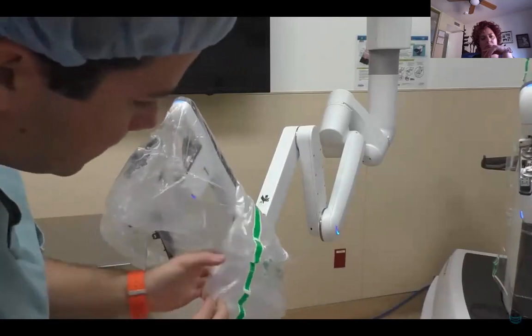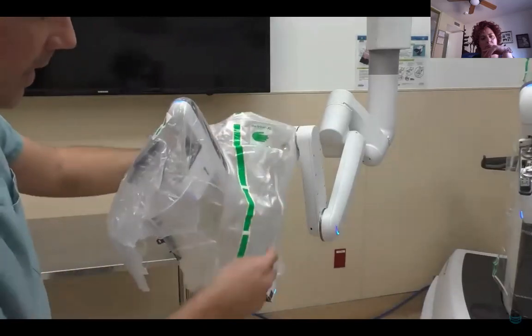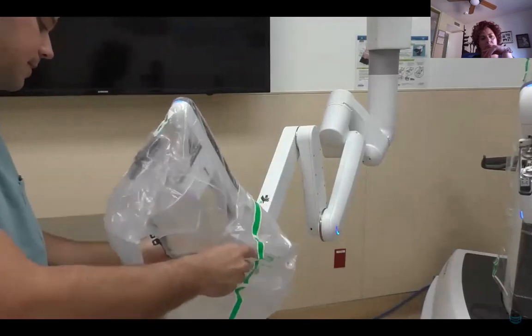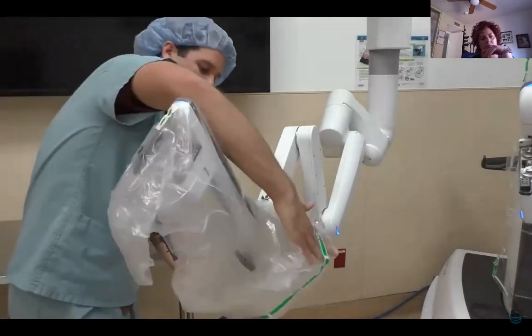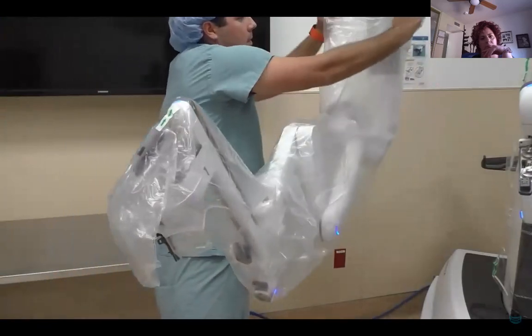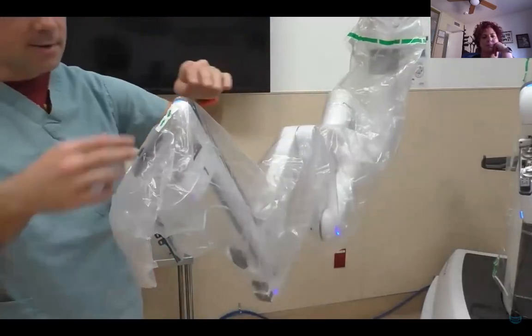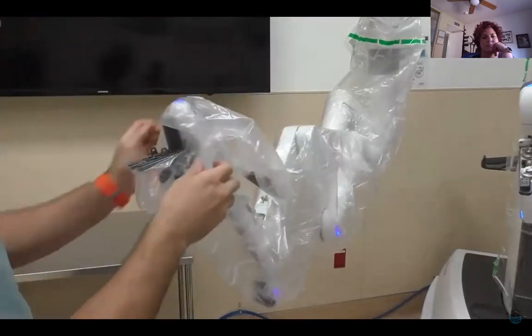Next thing you need to do is you'll notice that on the drape, we have two little hands. We have a hand here, we have a hand here with our magnets above each hand. That's telling you that you need to take both of your hands and slide them in these cuffs. You're going to then pull the drape all the way up the arm and attach the magnet pad. It's as simple as that. Kind of pull some of the slack out. We're going to undo this tape, bring this down a little bit.